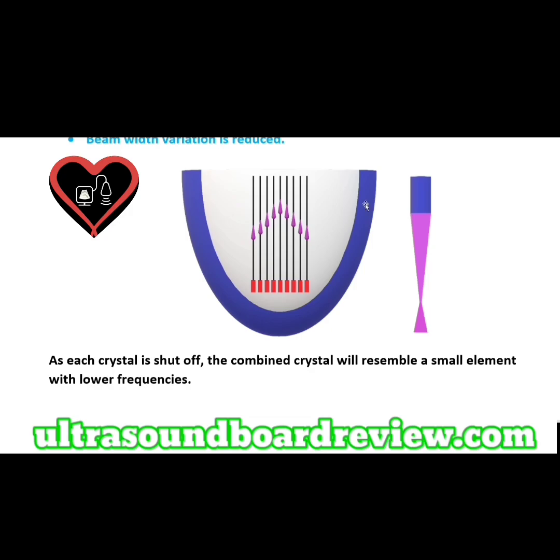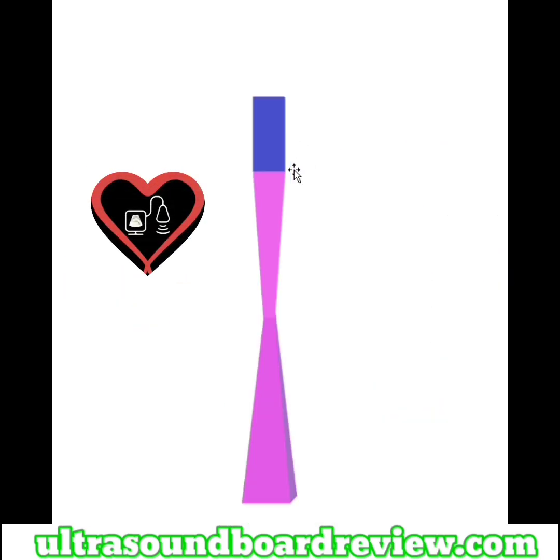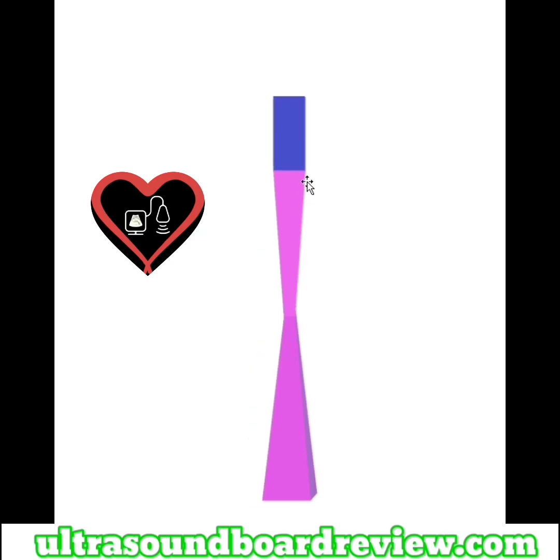When you increase your frequency, your penetration will go down. When we increase our operating frequency, our penetration will decrease. So it would look like this. This is a great example of a diagram that shows what happens when you increase your operating frequency, because your focal depth or your focal length will increase when you increase your operating frequency.